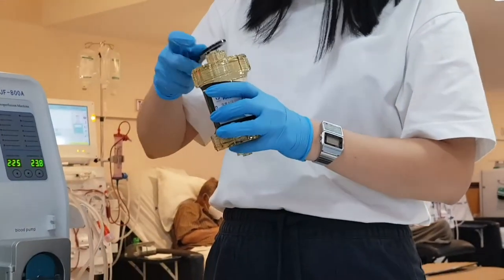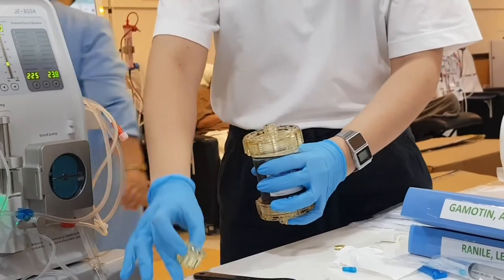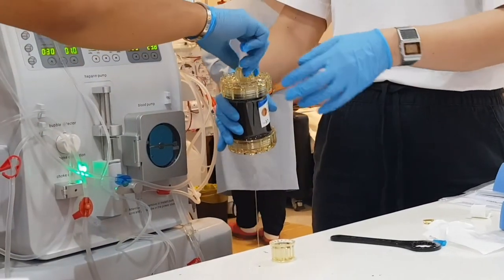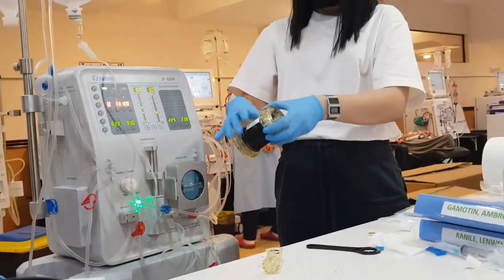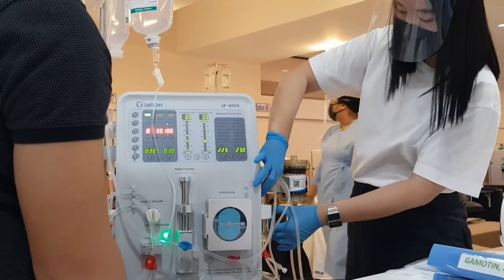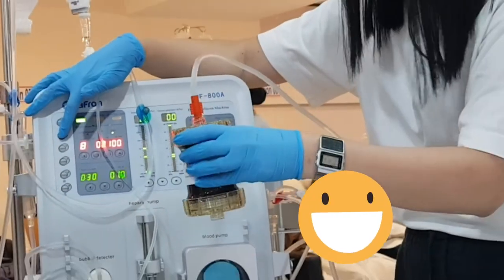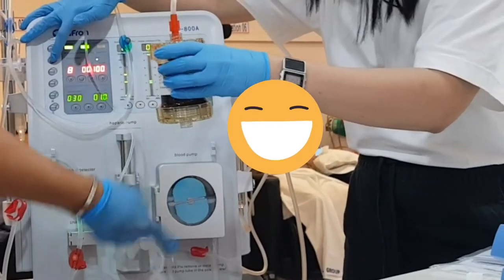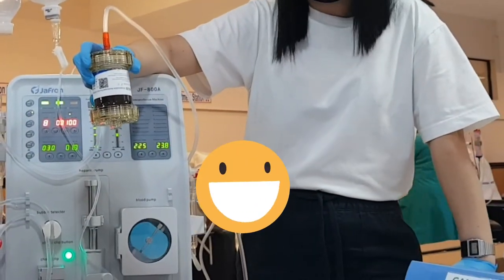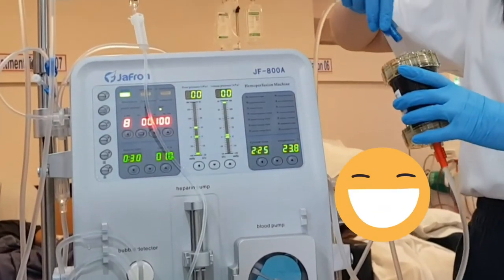Next is the hemoperfusion cartridge. First step is to drain the sterilant by opening both end covers. The arterial dialyzer end is at the bottom, based on the cartridge label orientation. Don't forget to place the chamber on its proper placement before starting the blood pump. Drain the D5 water solution and wait until it is consumed. Once done, stop the blood pump, then connect the venous dialyzer end at the top header.